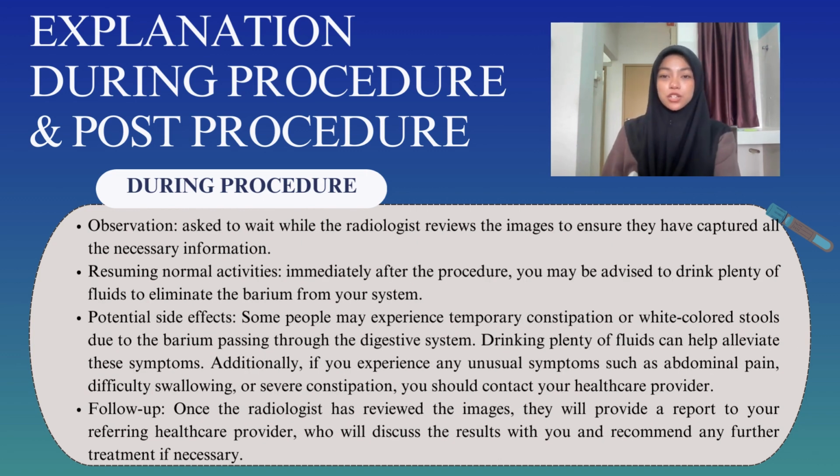Now is the explanation of post-procedure. Observation: you may have to wait while the radiologist reviews the images to ensure they have captured all the necessary information. Resuming normal activities: usually immediately after the procedure, but you may be advised to drink plenty of fluids to eliminate the barium from your system. Potential side effects: some people may experience temporary constipation or white-colored stool due to barium passing through the digestive system. Drinking plenty of fluids can help alleviate this.